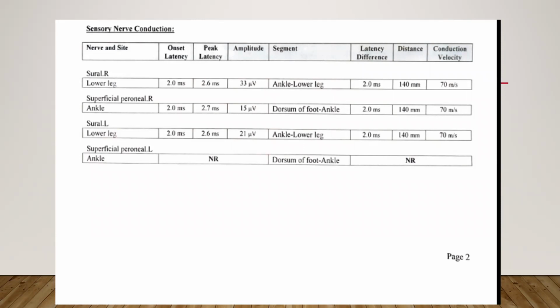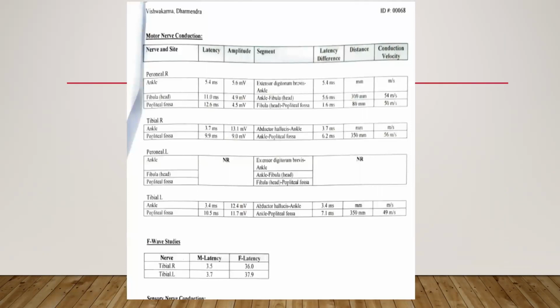So what muscles will you needle now? So according to you, this is a left common peroneal neuropathy. Correct. Yes. So now you have to give a localization of this common peroneal neuropathy, whether it is happening at the fibular neck, or in the mid thigh or just above the popliteal fossa. These two things you have to find out. Why just above the popliteal fossa? Because it is a common peroneal nerve which is involved, so it can be either above the popliteal fossa or at the fibular neck.